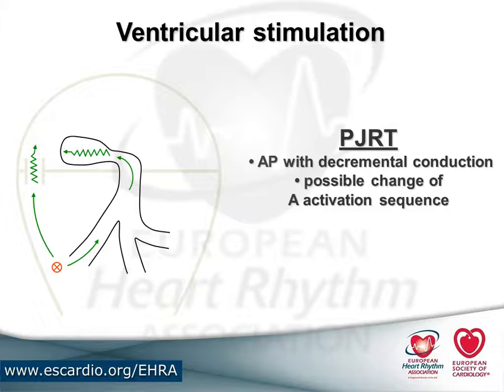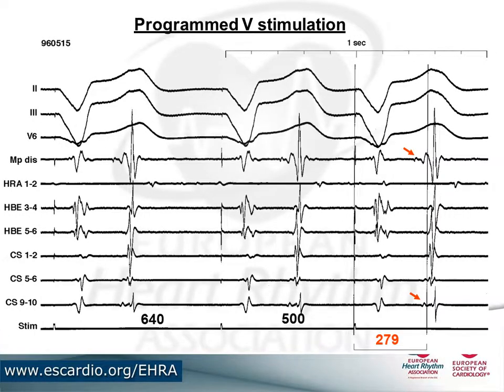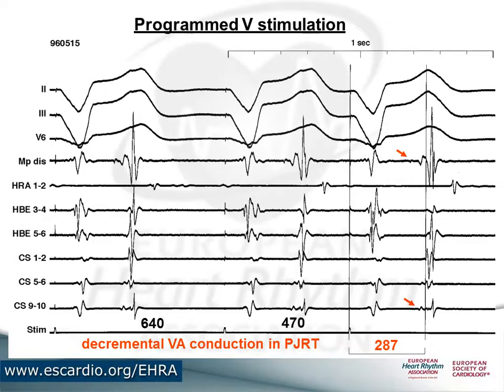PJRT. PJRT are permanent junctional reentrant tachycardias on the basis of an accessory pathway with decremental conduction. Mostly young patients, and they have quite an interesting thing. In that programmed stimulation that I told you before, you're going to see decremental conduction. And you see already a long VA interval, but you see a tiny signal here. And you're going to see you induce a junctional tachycardia with a negative P wave, and then it carries on. I think the ECGs that we showed before were actually quite nice. You can see here when I bring the S2 in, it gets longer and longer and longer.